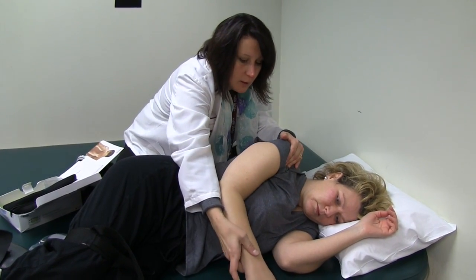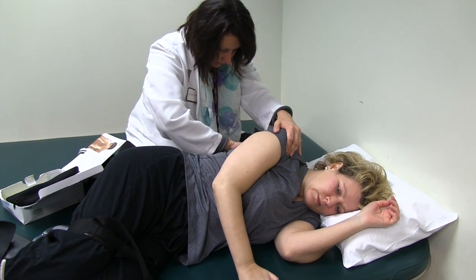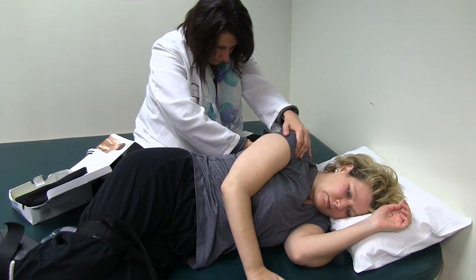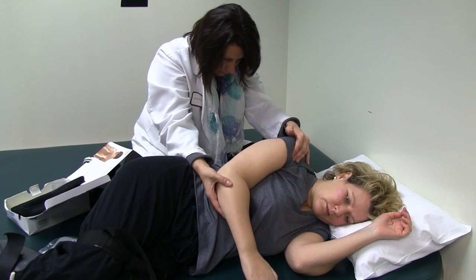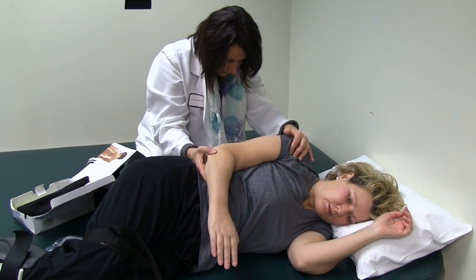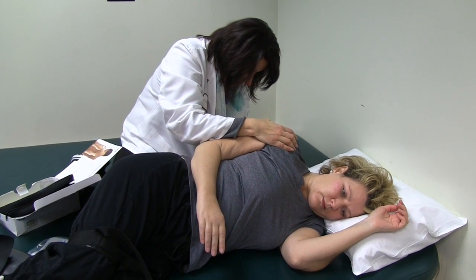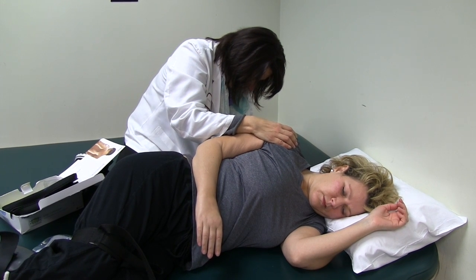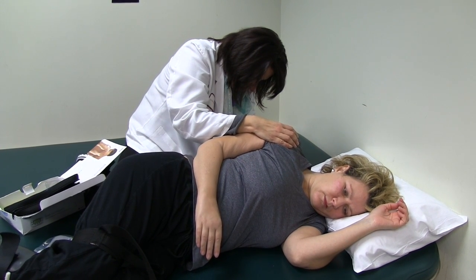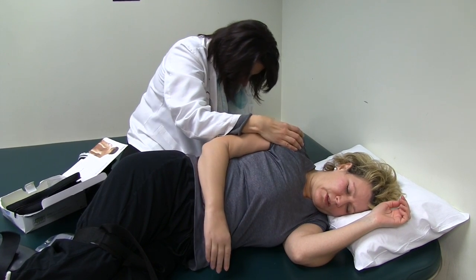Come forward a little bit, and I'm going to have your arm come forward so as it comes back you're really feeling that muscle come in with the stim. Now work with me — pull it back. Pull that arm back. Pull that wing bone — shoulder blade down and back. Are you comfortable? It's not hurting? Yes, I'm comfortable, it's not hurting.